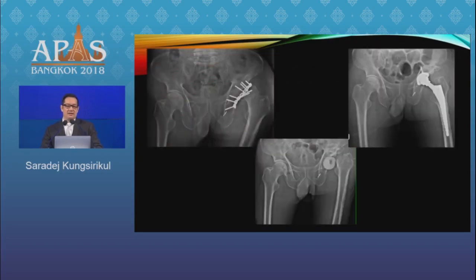To prevent complications, this group has more risk of heterotopic ossification, infection, and dislocation. In this case, they had an infection and also dislocation before the total hip. We have to remove the implant to use the two-stage total hip, and intraoperatively we have to lengthen the femur to protect against dislocation. You see the femoral head has a skirt, and luckily, finally, the patient has a stable hip.